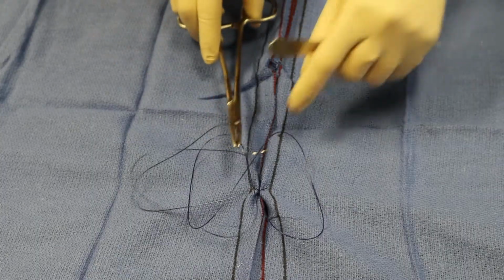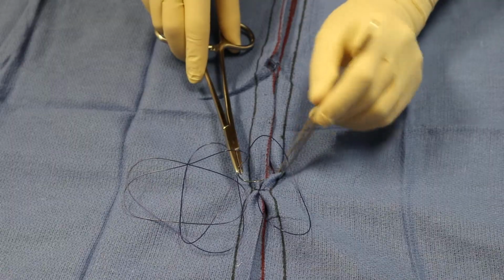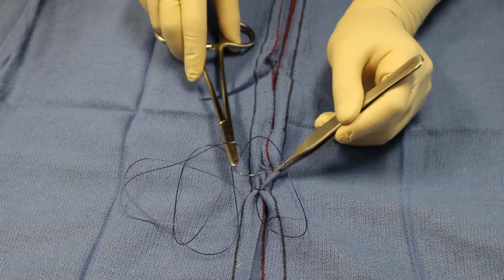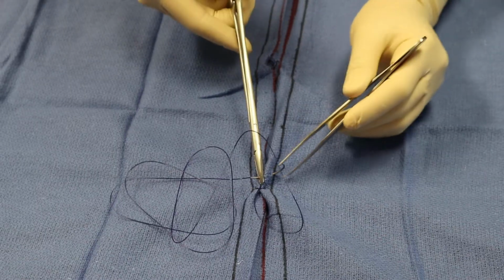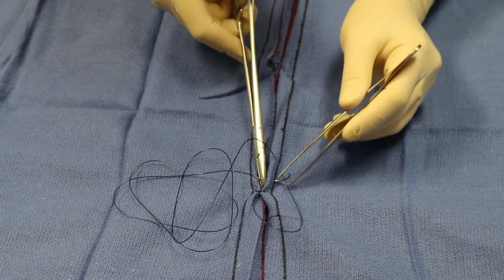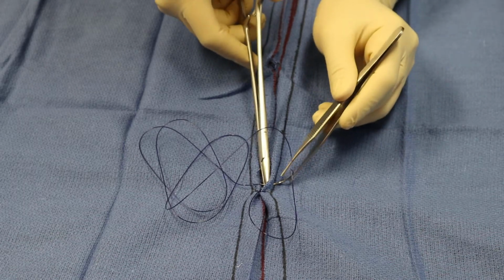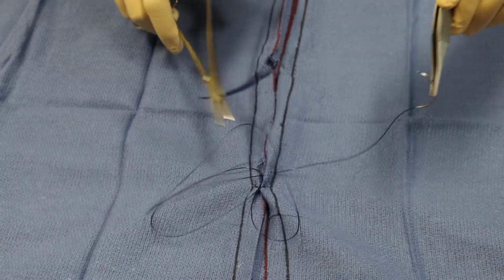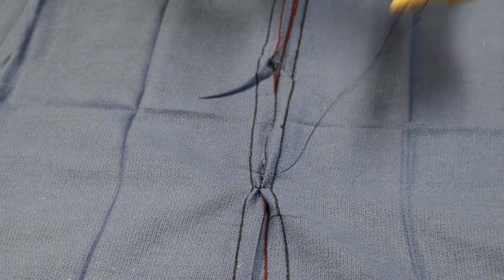So I just kind of do the same thing. Just another half Lembert bite, red line to black line. And now you're superficial again. So since you're superficial, you can go ahead and start the Cushing or Connell or Utrecht, because those all begin superficial. So that's the one difference in burying a knot between the Lembert and then the other 3 patterns, is you just have to do that one extra bite to get back superficial.